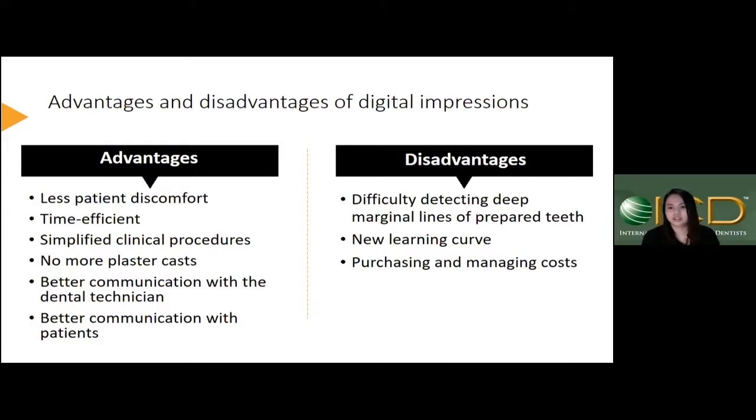to scan the deep part. And there is a new learning curve, so we have to learn and get familiar with the CAD/CAM system and 3D printing. And there's also increased cost when purchasing the machine and managing the machine.